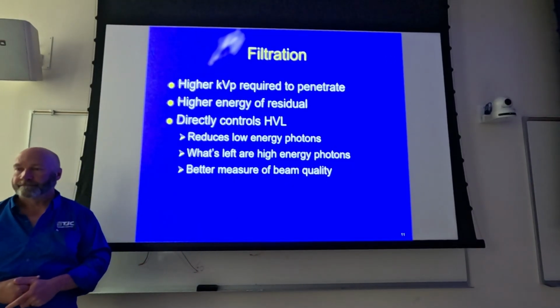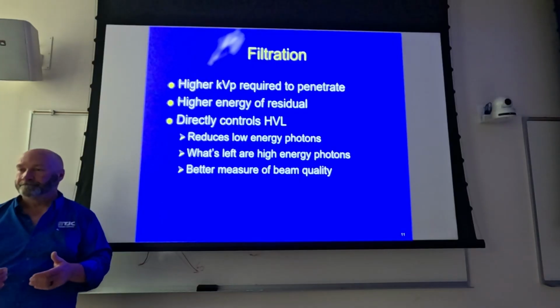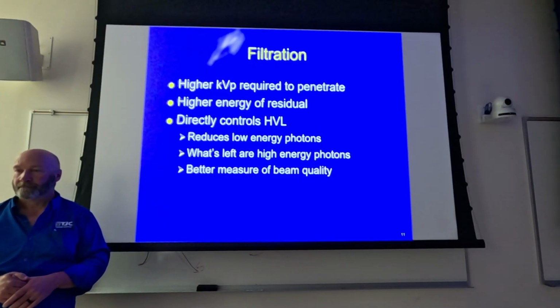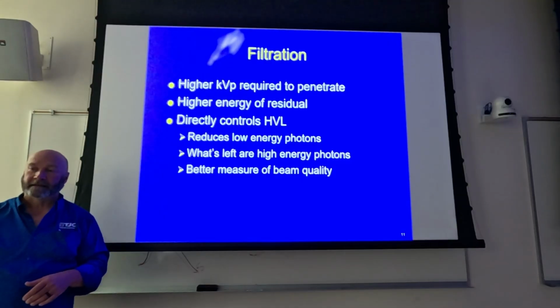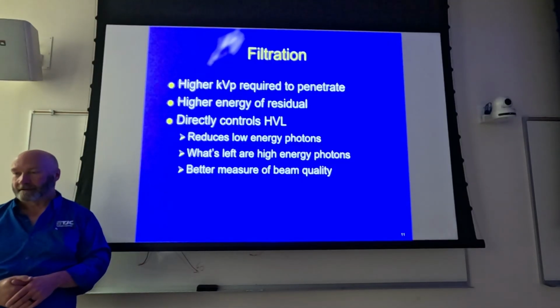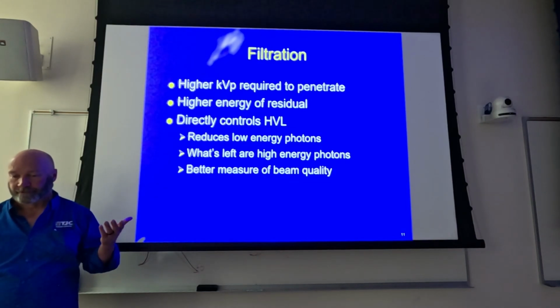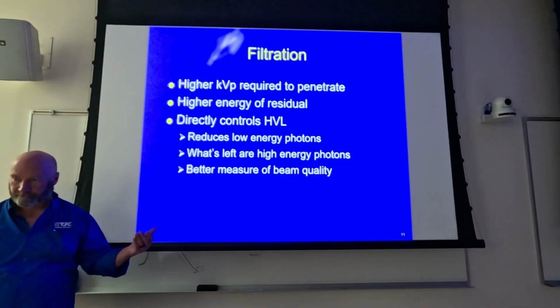Especially when there are two machines, maybe one's 5 years old and they've done that test on the mA, you can use the half value layer because that takes into account not just kVp, but the other stuff, because they had to change that. Yeah, it takes into consideration the penetrability. So what they'll do is measure just the output, and then do the half value layer.